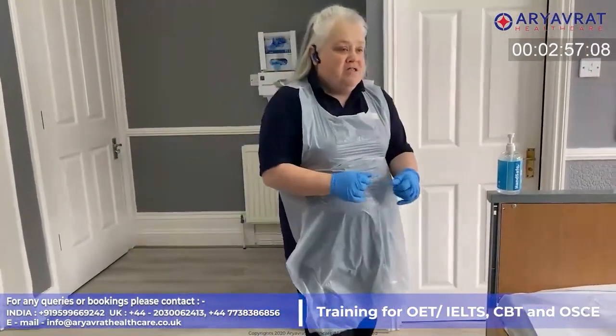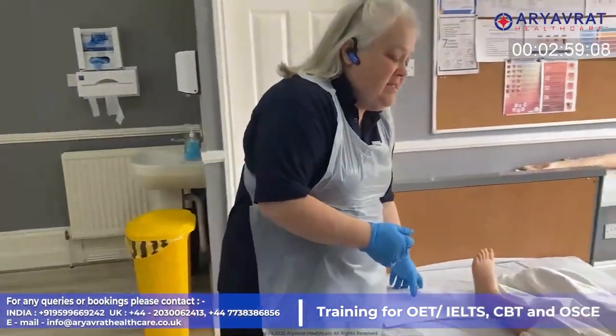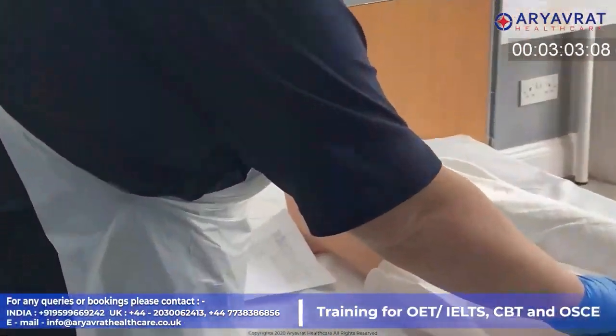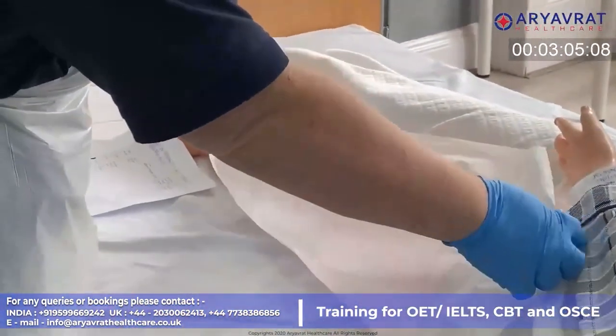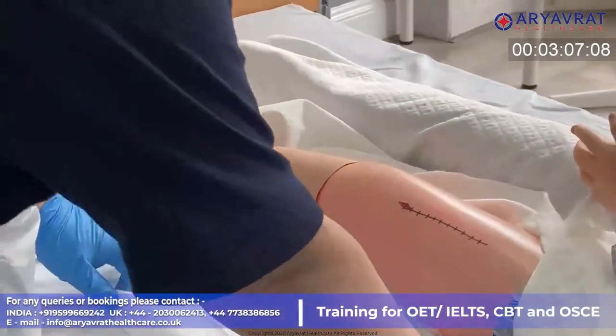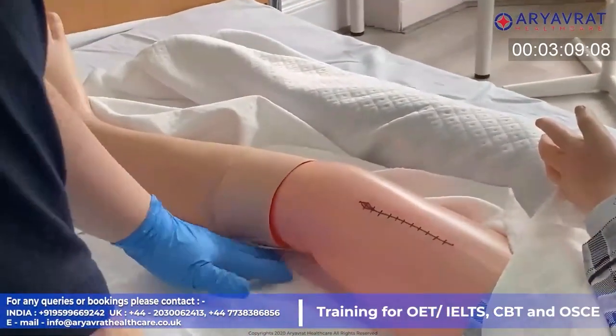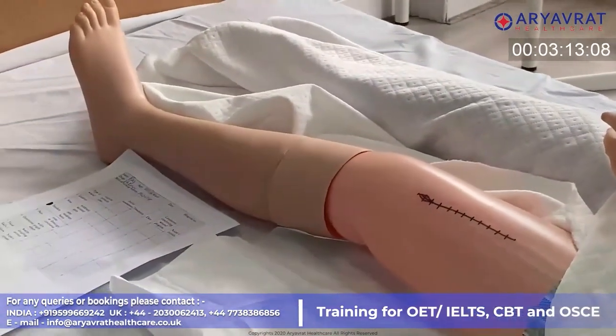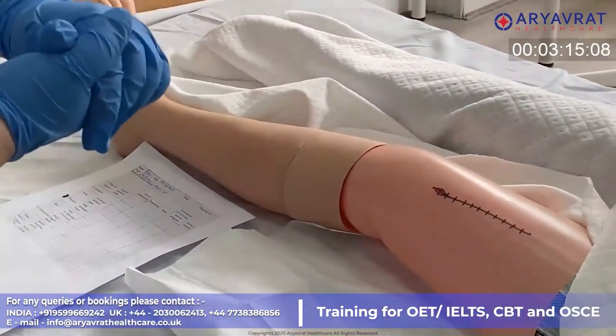Hi Raj, I'm back. Are you happy to proceed? Yes, I am. Okay, so I'm just going to expose your wound here. So we're looking at a 48-hour post-op surgical wound. Is that right, Raj? Yes.